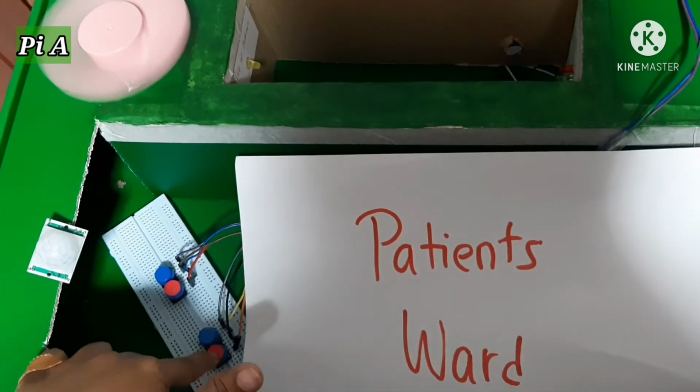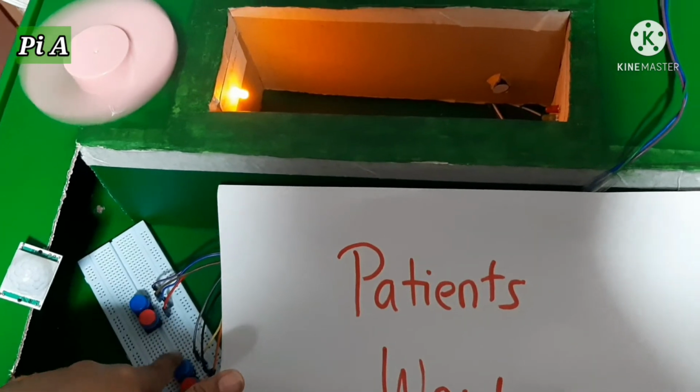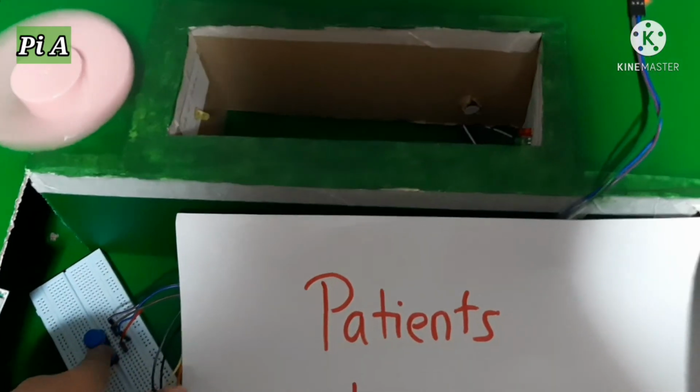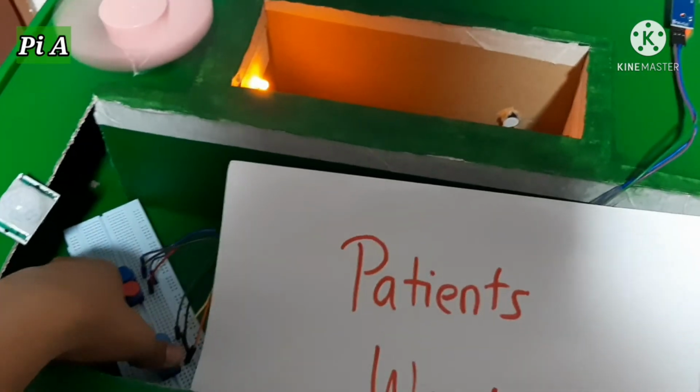The red button indicates help needed, and if pressed, the yellow LED in the MU room will turn on. The blue button indicates cancel help, and if pressed, the LED will turn off. There are two pairs of buttons. One pair is near the cubicle side and the other pair is near the shower side.